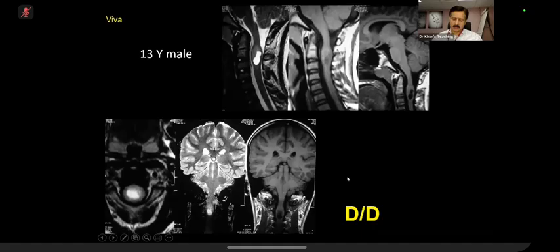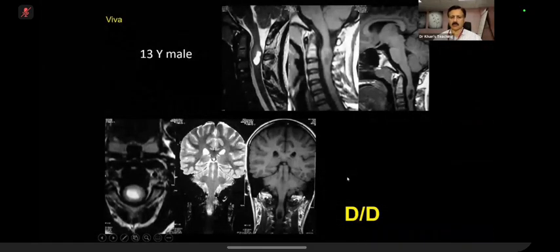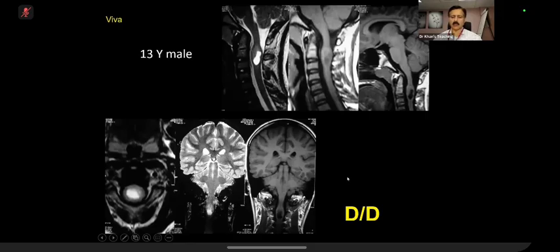Right. So, okay, your general thinking is fine, but my take-home point for you will be that it is good to tell the examiner your thinking, as you have just told me. But ependymoma and astrocytoma will always go together. You are right that in this age group, astrocytoma is more common, ependymoma in the adult population is more common. You are right that hemorrhage goes in favor of ependymoma, but the counter argument is that both of them can occur in each age group.